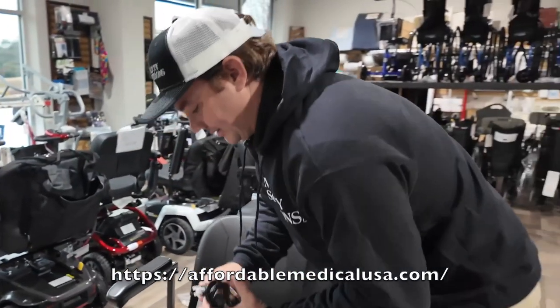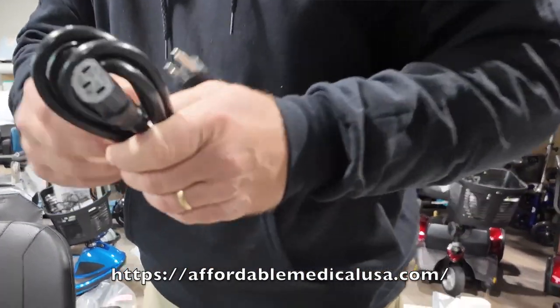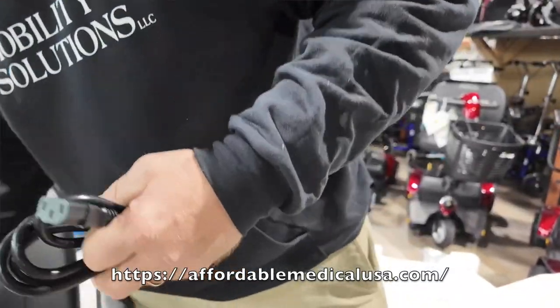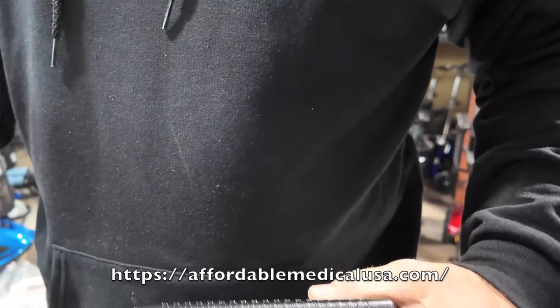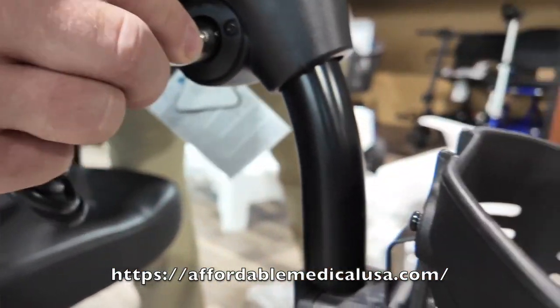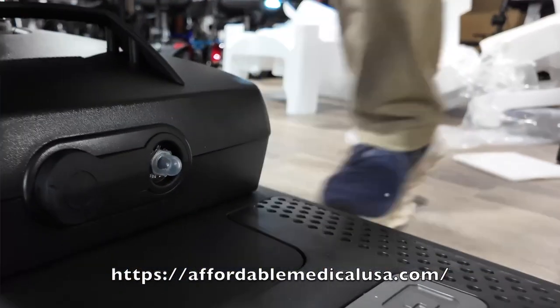Take the little plastic piece off the charger and unravel the cord. Plug this in, then take the other end and plug it either directly into the port up on the scooter or into the battery pack.